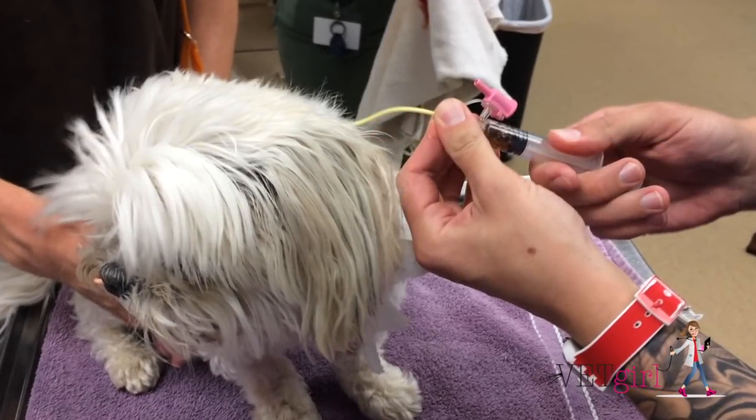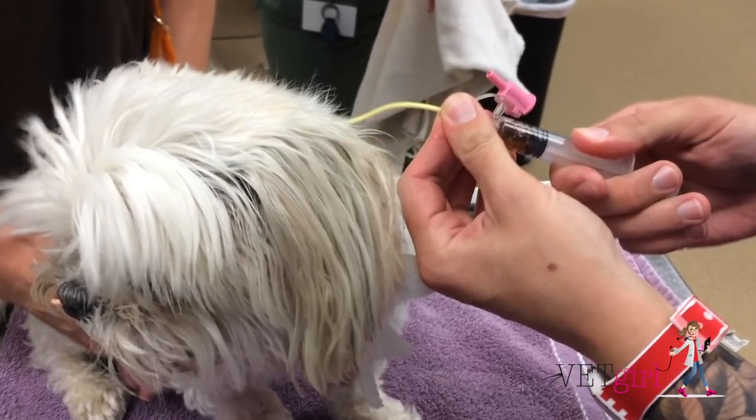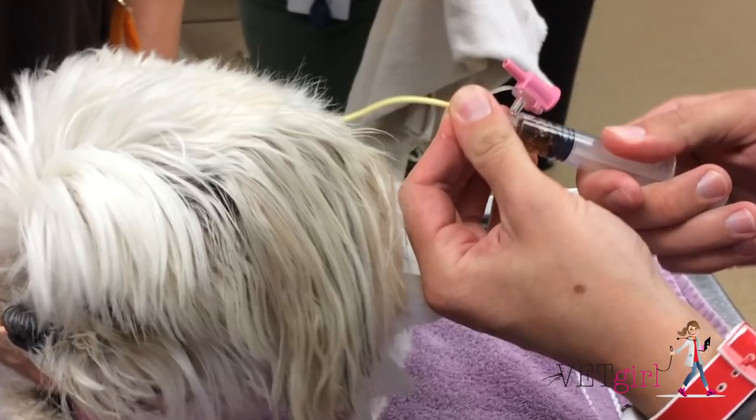In this video, we demonstrate how to unclog a nasogastric, or what we call NG, feeding tube in a dog.